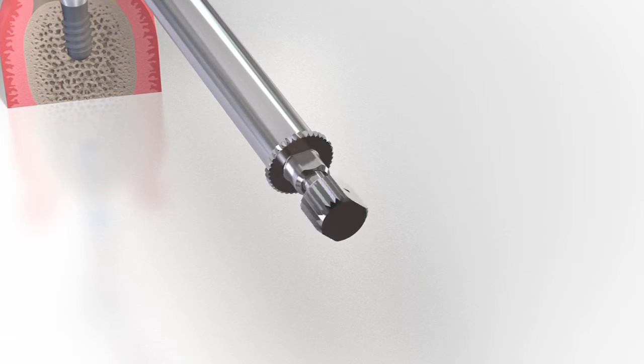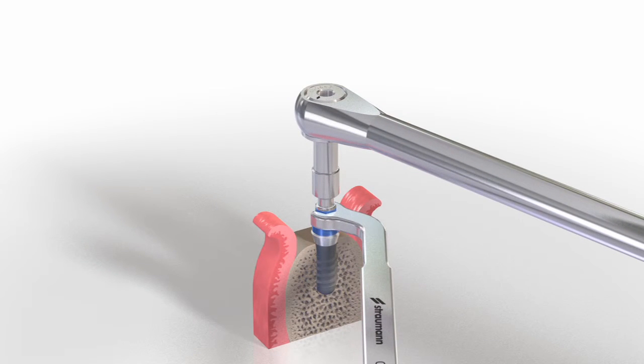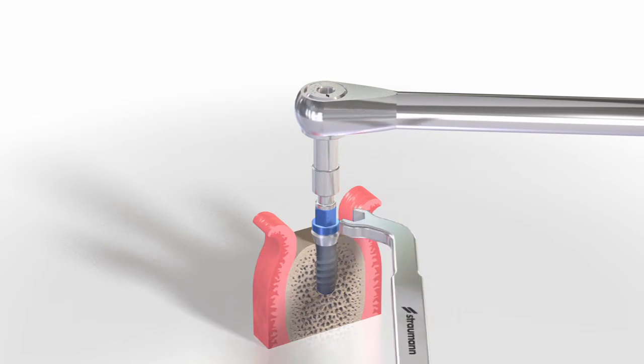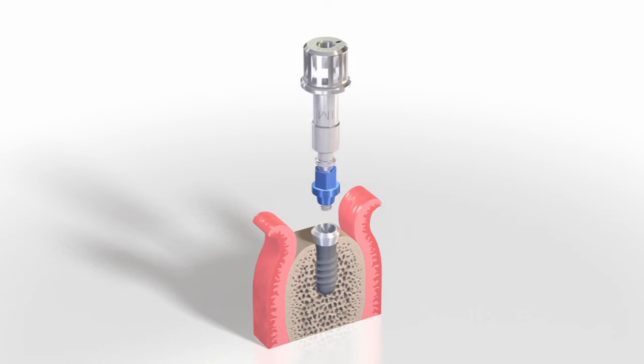The direction of the ratchet is changed so that the arrow on the knob points counterclockwise. The holding key is used to counter the hexagon and loosen the transfer part counterclockwise with the ratchet. The holding key is removed, followed by the ratchet, while the adapter is held at the bottom. Finally, the transfer part is removed from the implant. The adapter is still completely mounted.